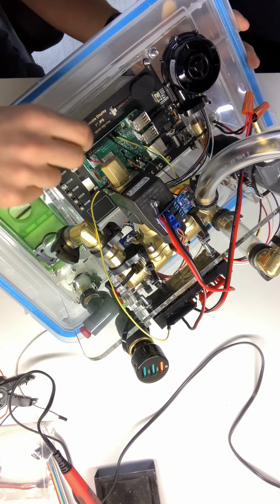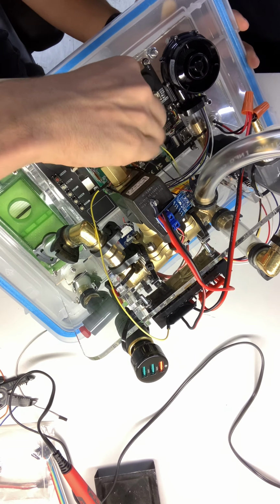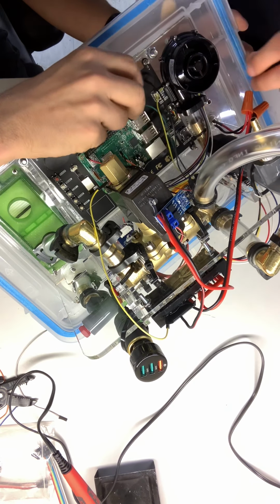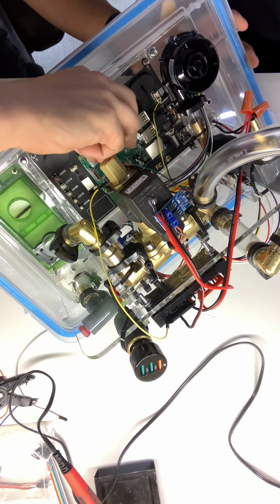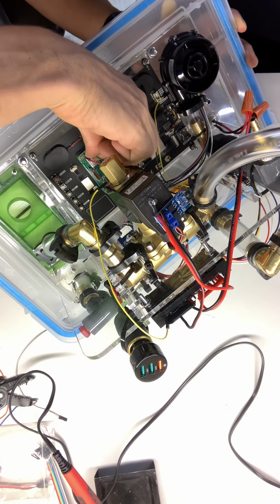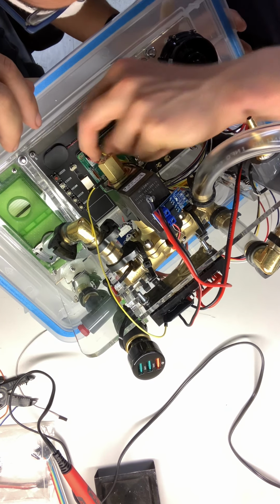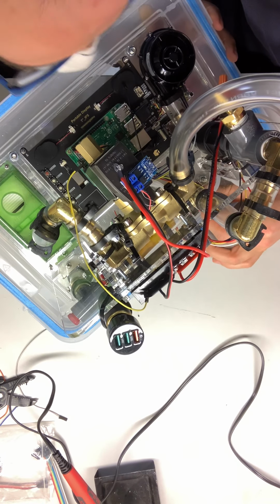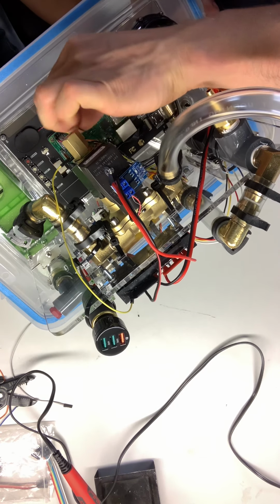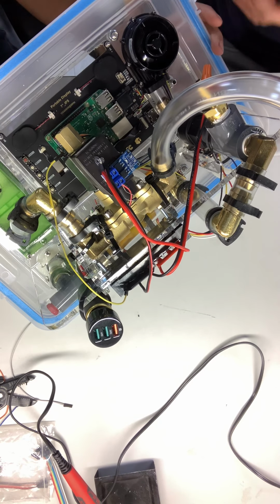Mm-hmm. And then green, it's on the inside, 4 down on the outside. Actually, just pull this off. They're gonna move anyway. True. 4 down on the outside. And then 5, yellow. Is it lifting up? No, it's in there. It's just got to be in its hole. And then 7 is black. Cool. Good check. Yeah, we found something.